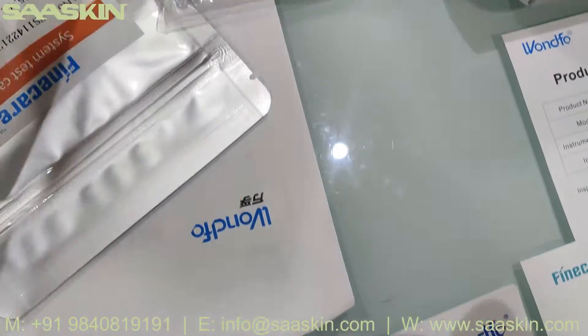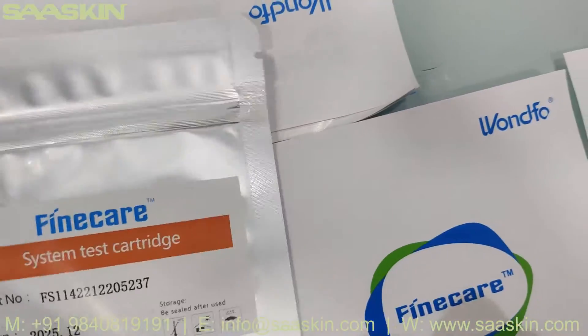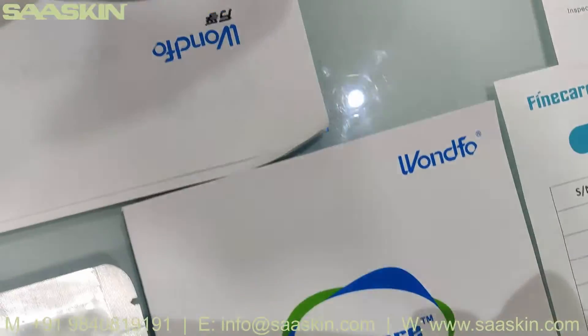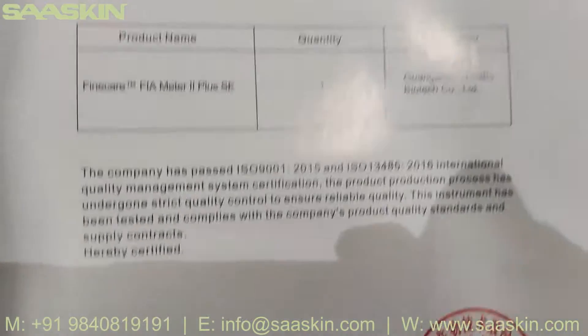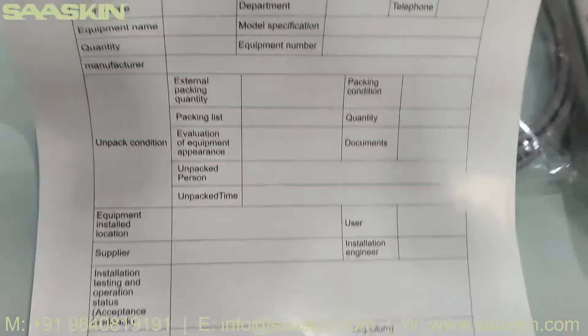There is a data cable. And there are system test cartridges. You can see the system test cartridges — a large number comes along with the machine. Then there is a quality certificate for this machine with the mission number and details. And there is an acceptance form.